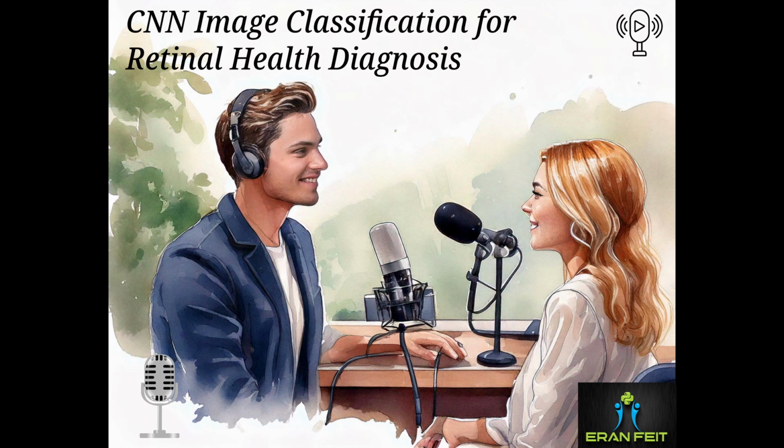Gotcha. So we've prepped the images. There are learning materials. Now, how about the brain? This is where we get to the CNN architecture design, right? Yeah, that's the next step. CNN stands for Convolutional Neural Network, and it's specifically designed to work with images. Okay, so it's kind of like building the brain of our AI eye doctor. Yeah, you could say that. It's made up of layers of artificial neurons that can learn to recognize patterns in the images. Whoa, hold on. So we're teaching a computer to actually see. Pretty much. Obviously, it's not exactly the same as human vision, but it can learn to recognize visual features in a similar way.